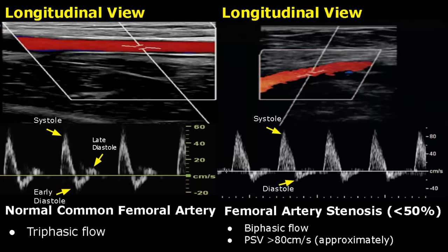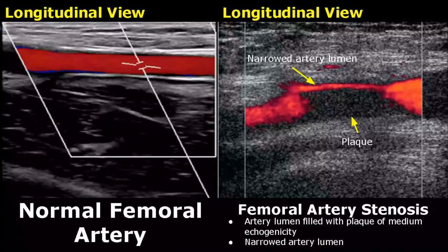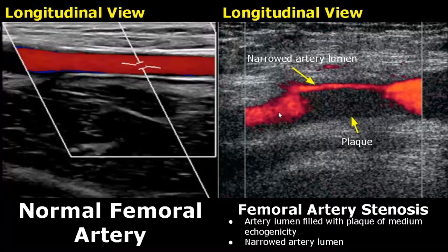In this image, power Doppler is applied. We can see the lumen of the artery is filled with a plaque of medium echogenicity, and the lumen of the artery is narrowed.